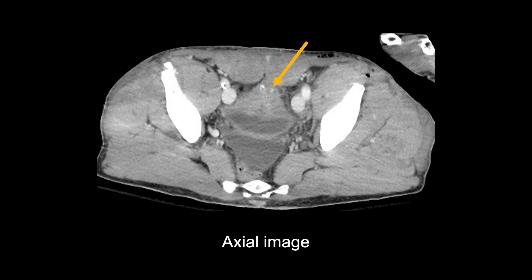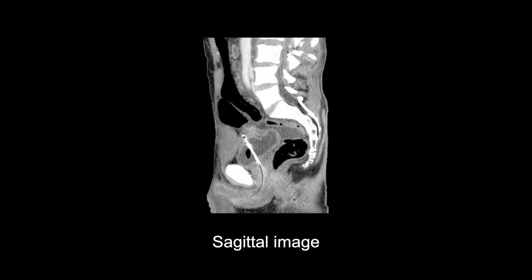In this case, there is unexplained free water density fluid of 15 Hounsfield units in the pelvis, raising suspicion of a bladder injury. The trauma CT sagittal image shows some thickening of the bladder dome, which increases our suspicion of an injury.